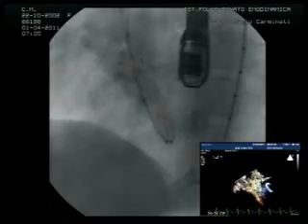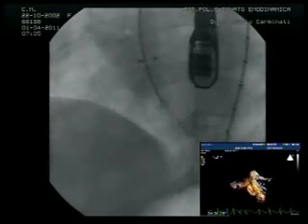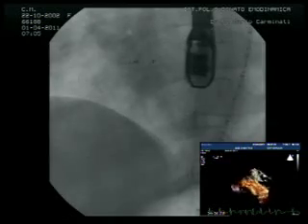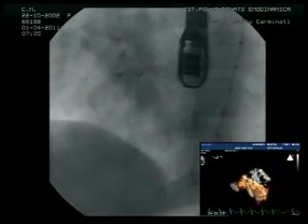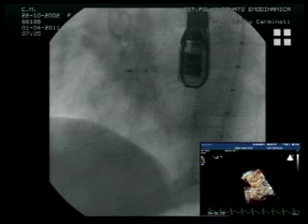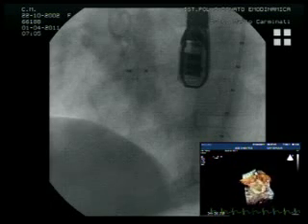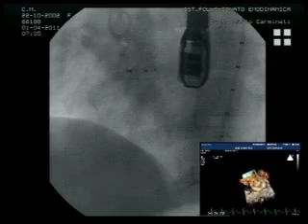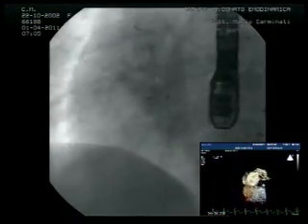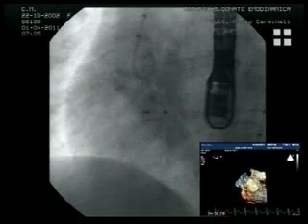Well, in our experience, we never had heart block by using a muscular VSD occluder. But of course, the risk is not zero in any procedure. But so far, we have sinus rhythm. We didn't have any problem of rhythm, so we are confident that with this kind of defect, with this kind of device, the risk of heart block is very, very low.